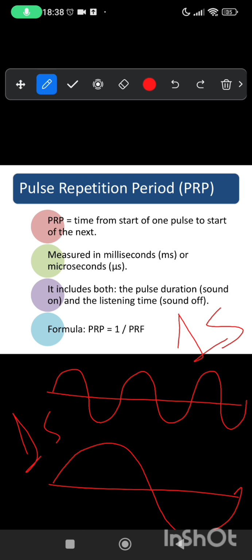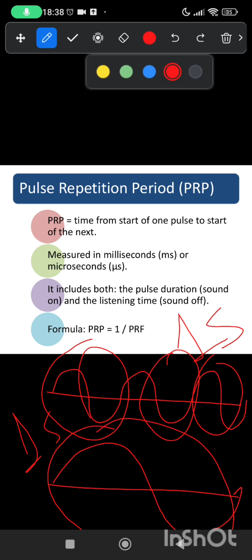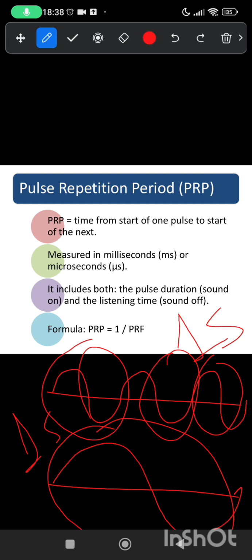So now this one cycle, it has more time, right? And here, because there are more number of cycles, I draw cycles here, but you can assume the full pulses. What is pulse? There are multiple cycles, then we say it a pulse.